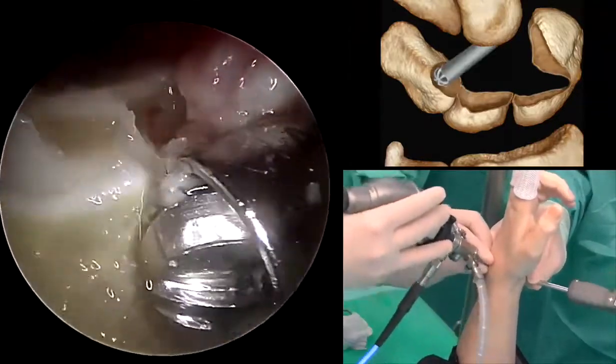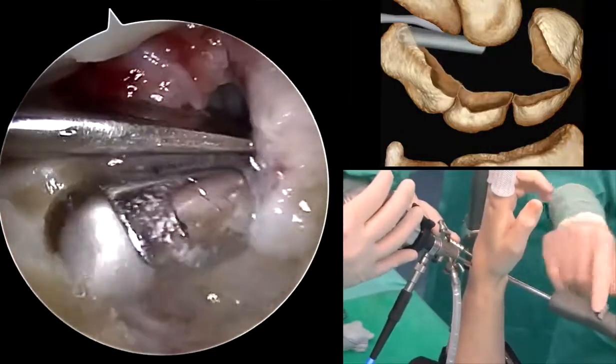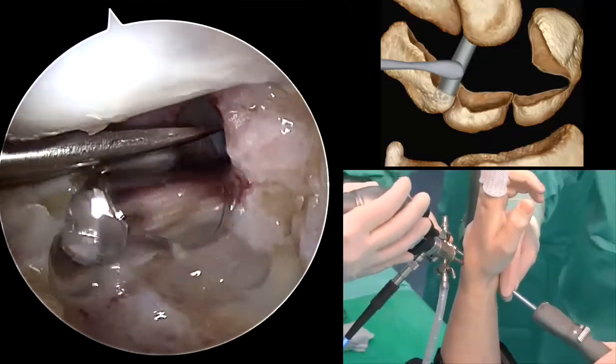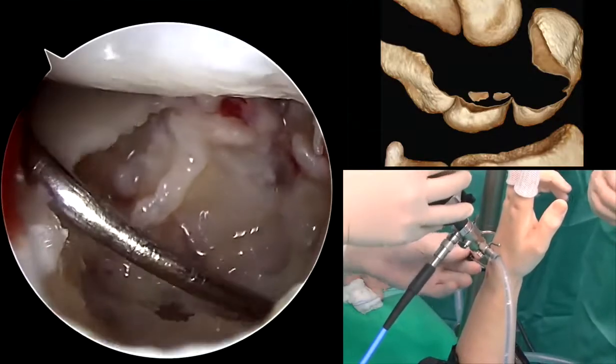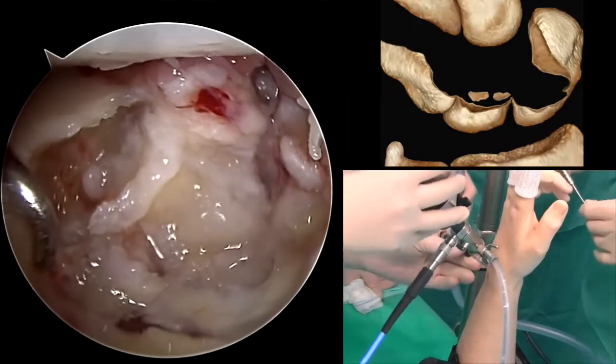The third bone to be resected is the volar portion of the triquetrum, using again the burr from volar and looking from dorsal through the radial midcarpal portal. Here you can see the aspect after the resection of the volar portion of the proximal row.